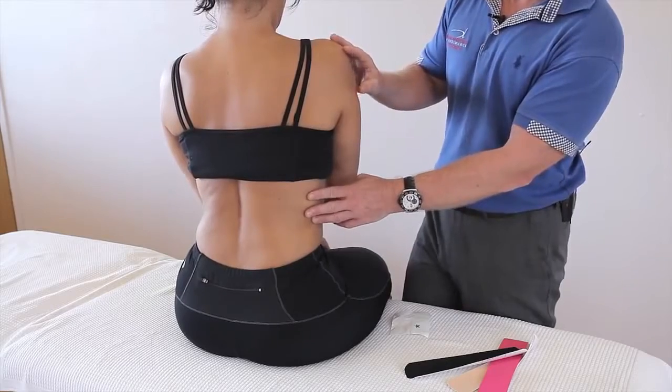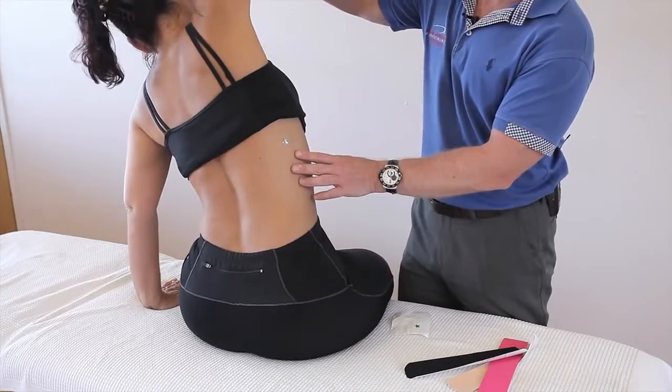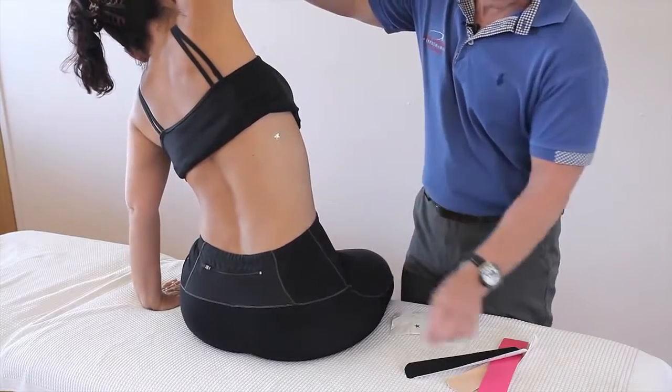First of all, we're going to try to put the patient into a stretch position. If they're able to reach over as far as comfortable, that might just be enough. If they can reach a bit further, that's fine. This is where the pain is.